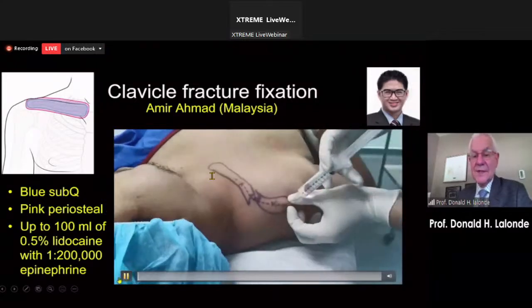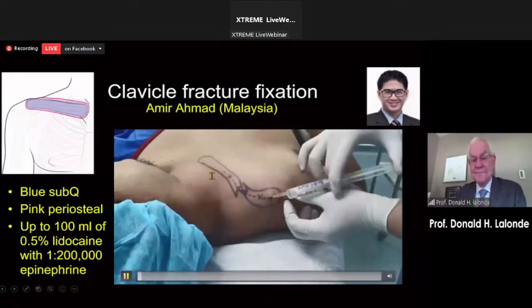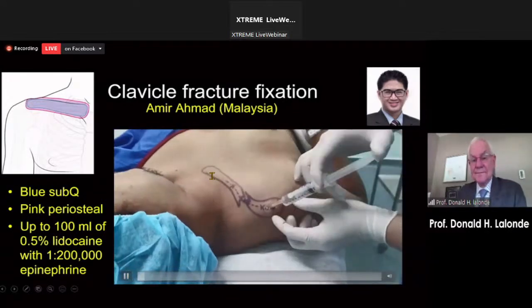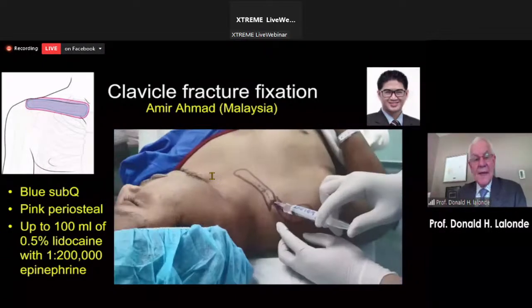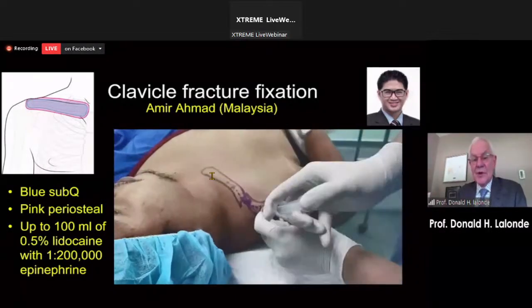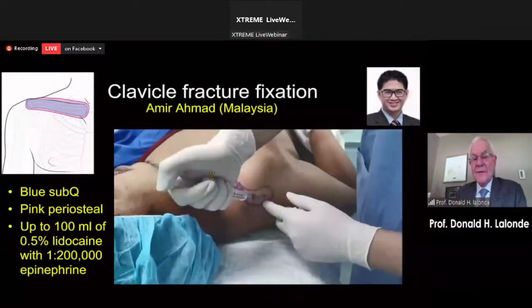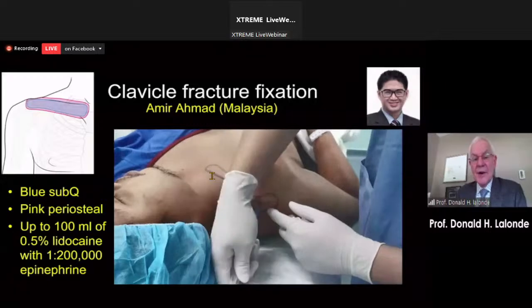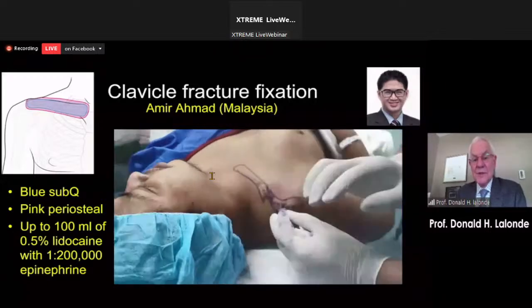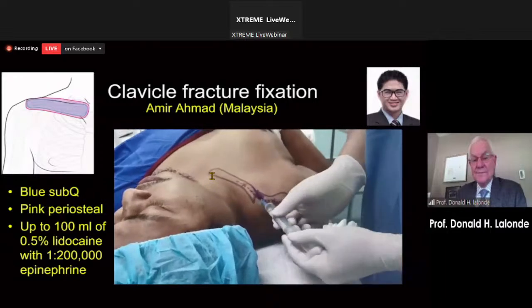And this is the video sped up. And the main thing is to put in a lot of volume, and now he's injecting on the periosteum. You have to bathe the entire periosteum of long bones. Now he's into the fracture hematoma.